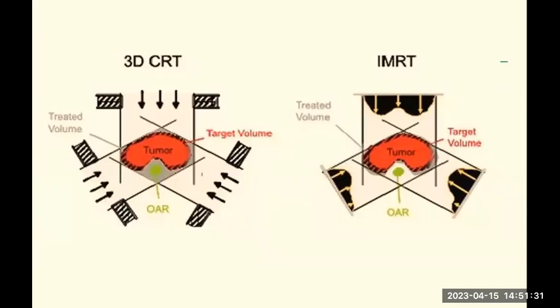That is what you call intensity modulated radiation therapy. For different areas, the radiation beam alone gets modulated. That is the pictorial comparison, and you can easily draw this.